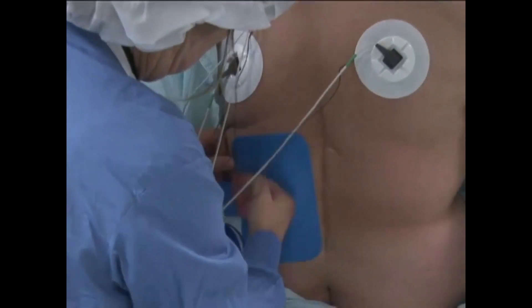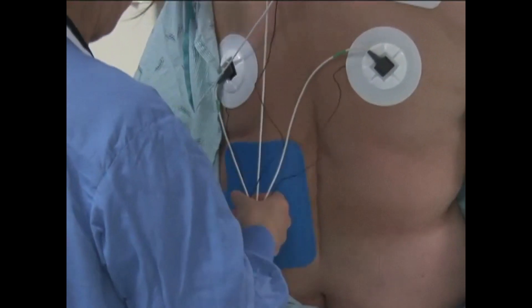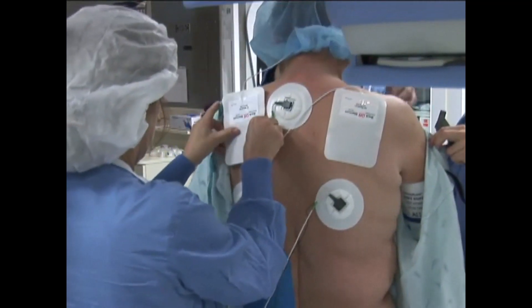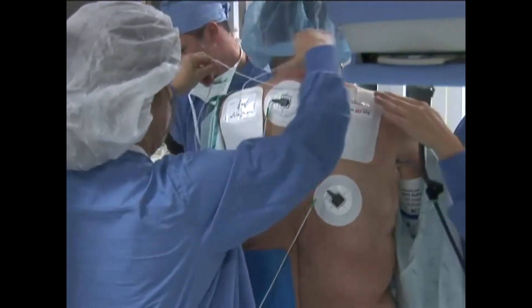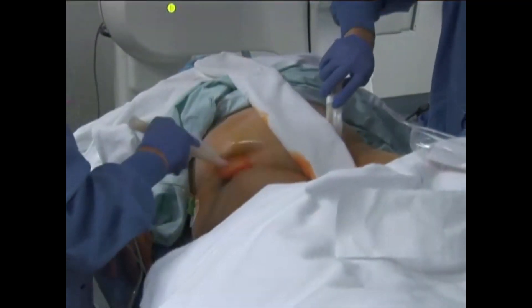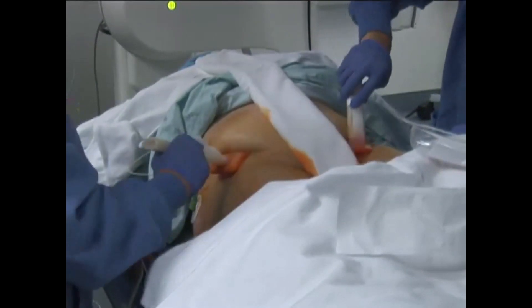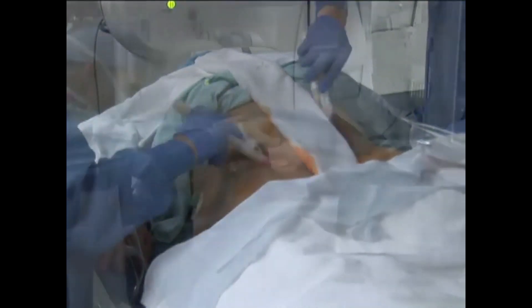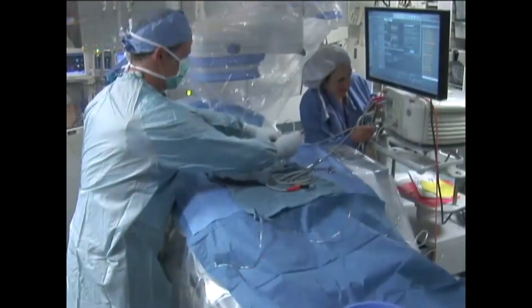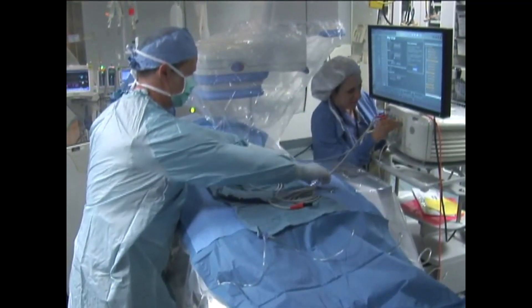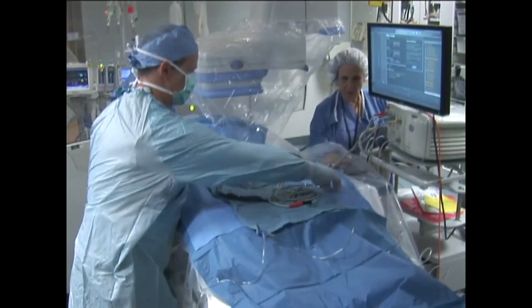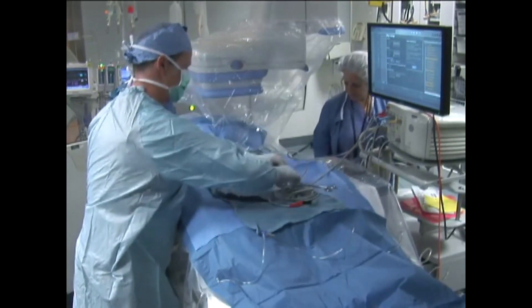The patient is brought into the electrophysiology laboratory and defibrillation patches, grounding pads, ECG leads, blood pressure cuff, oxygen saturation monitor, and three-dimensional mapping system patches are applied. The patient is prepped in the standard fashion. Femoral access is standardly used. After prepping the areas for venous access, sterile draping is applied and the catheter cables are plugged into the appropriate locations in the mapping system computer or the pin block to allow monitoring and recording during the procedure.